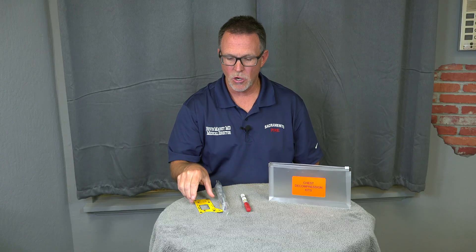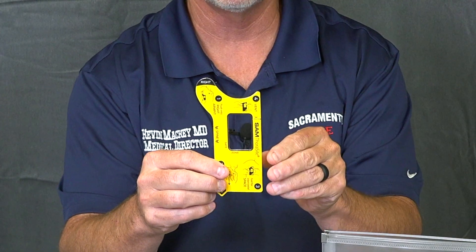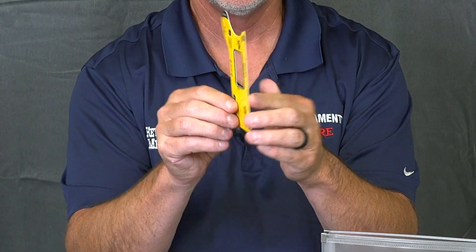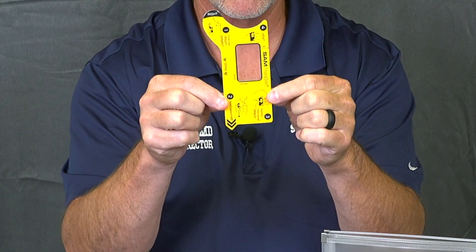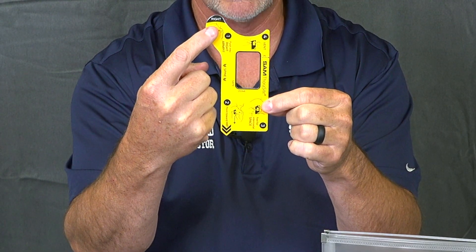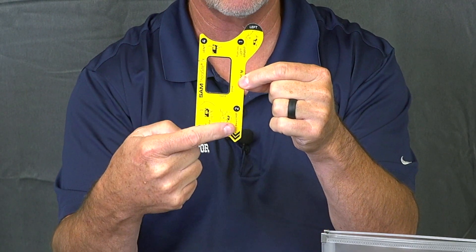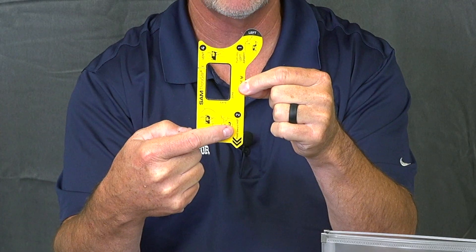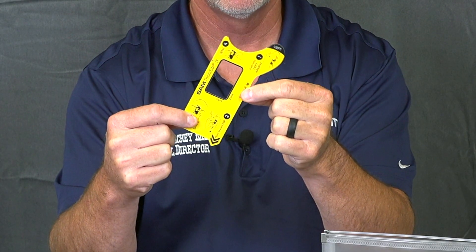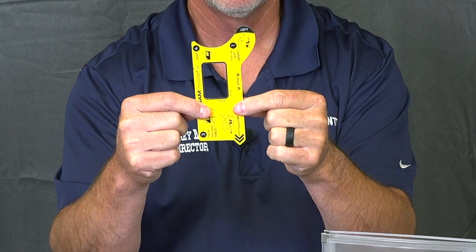So let's start with the SAM Thoracite. These cards are designed to be used on either the right side or the left side of the body. Notice how I'm holding it — this is the position it goes in. At the very top it will say either 'right' or 'left.' At the bottom of each card there will be another indicator that points to the hip. The reason for this is so that we don't point it too far forward or too far back, depending upon which side of the body you're on.